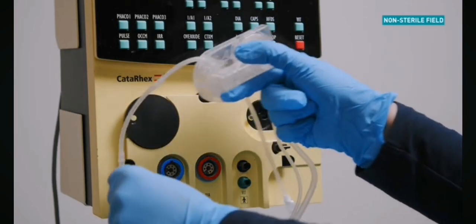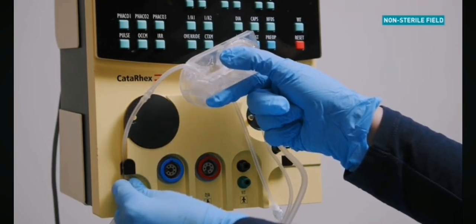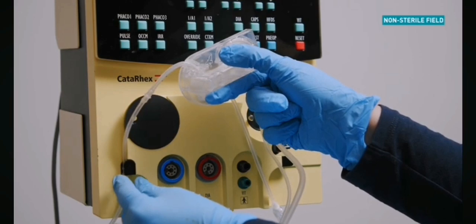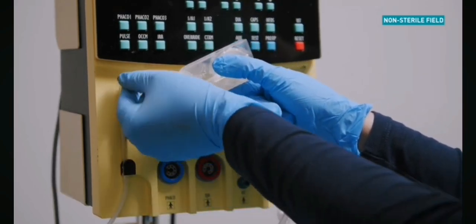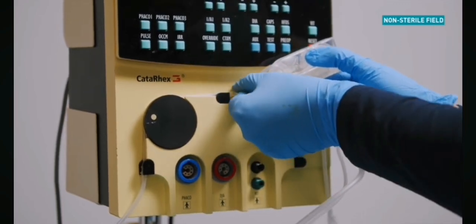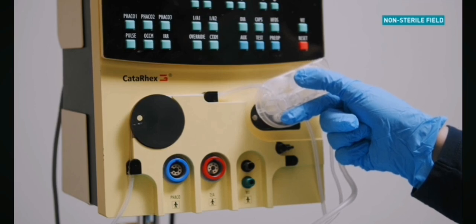Loop the tubing as follows: insert the locking mechanism into the first holding mount. The right hand holds the cassette and the left hand makes a loop with the aspiration line. Using your hand, grasp the second locking mechanism and gently pull the tubing over the pump wheel and secure into the second holding mount.